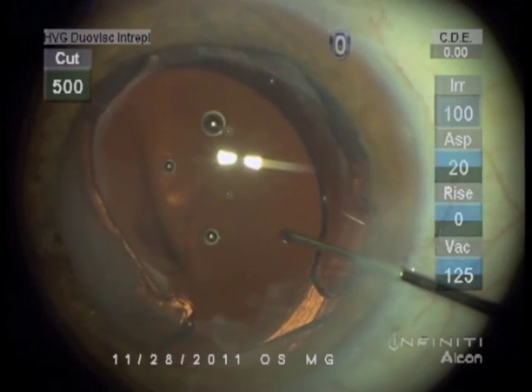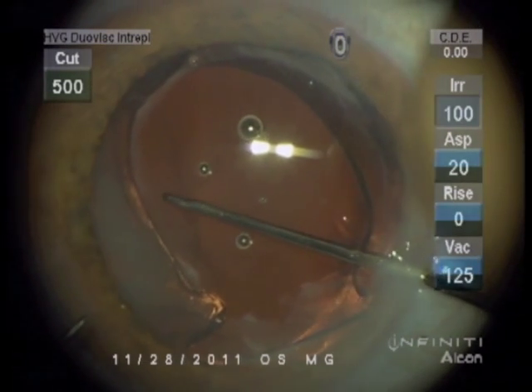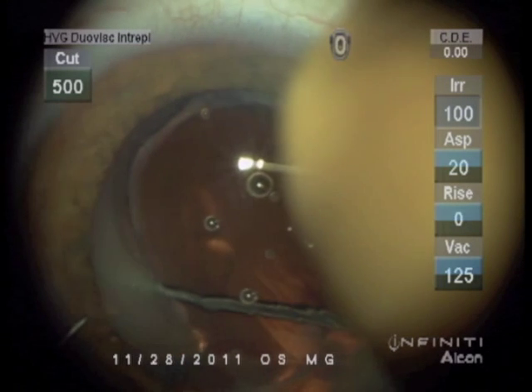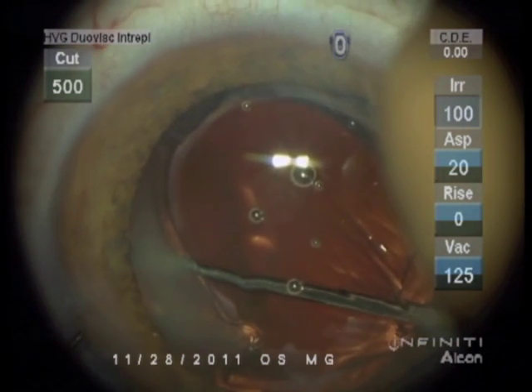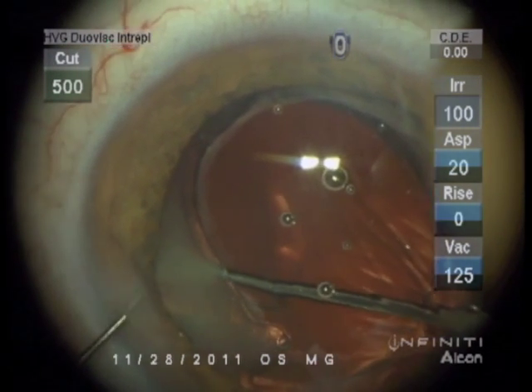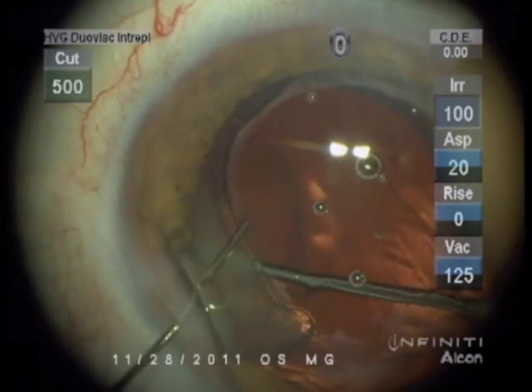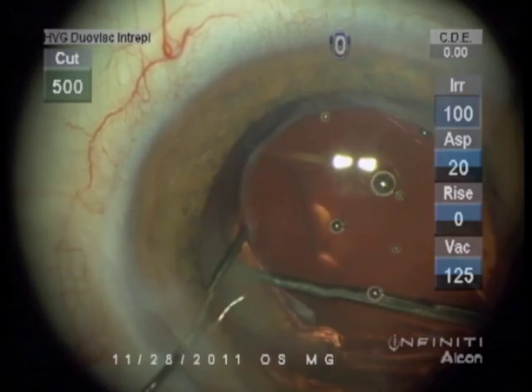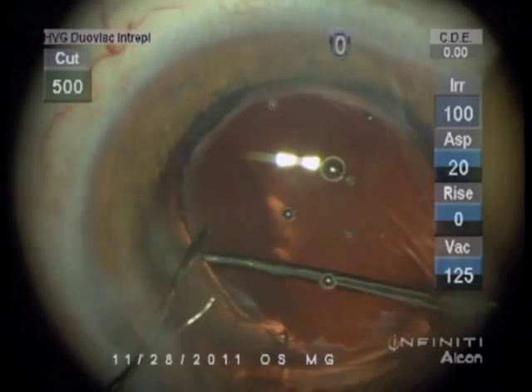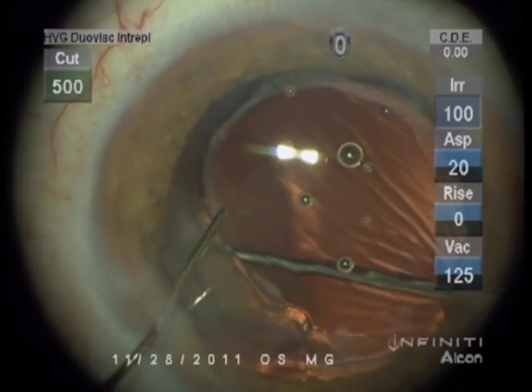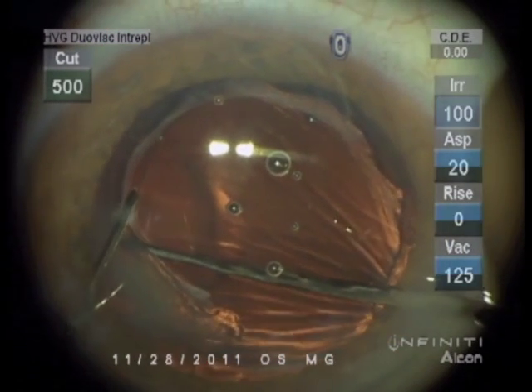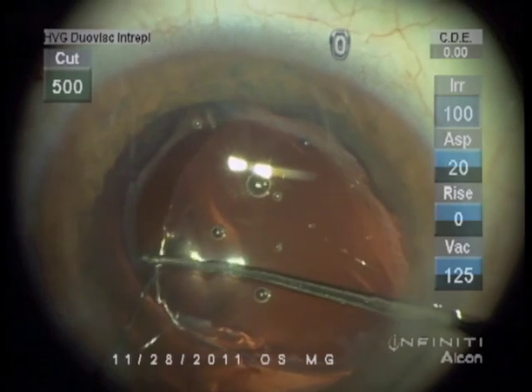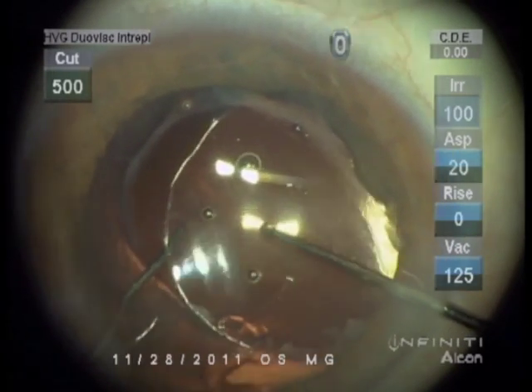After vitrectomy, fortunately the haptic in the bag was holding the lens stable. Now we're going to pull the optic up through the membrane to entrap it in the membrane opening, to give it stable center fixation without lens tilt.